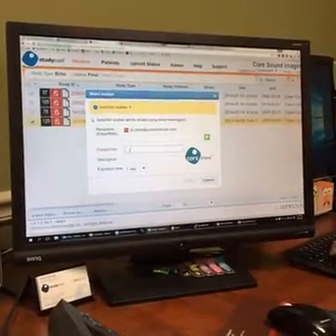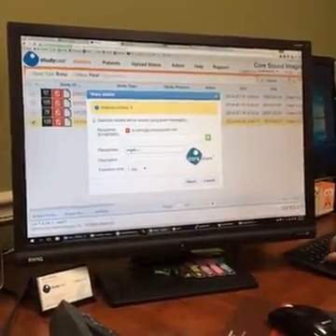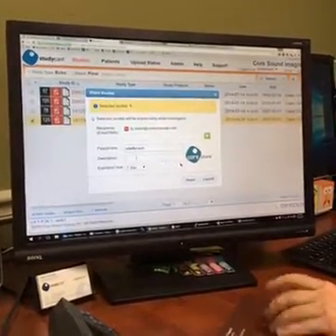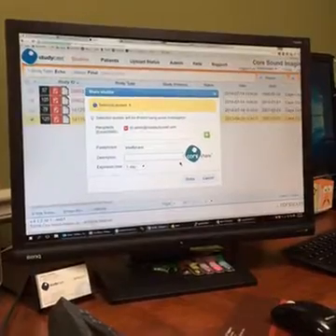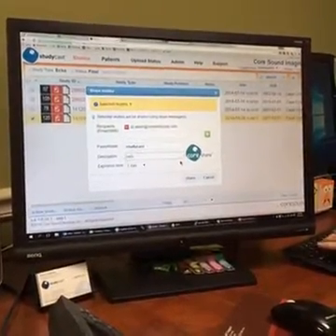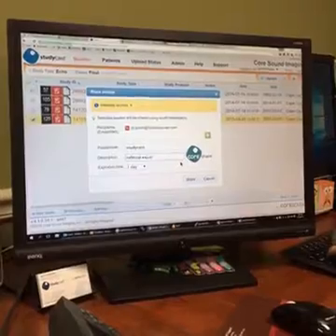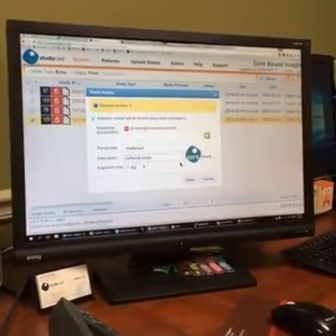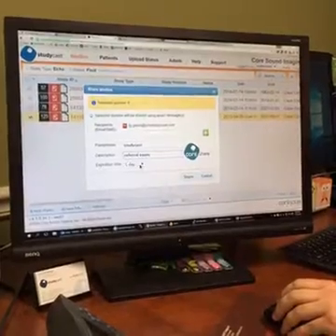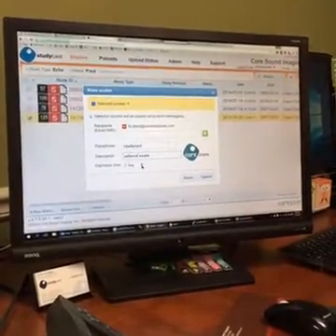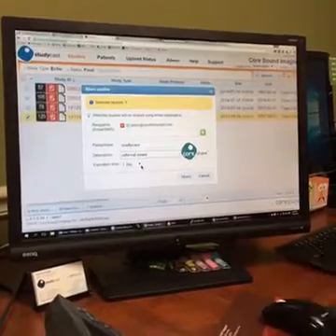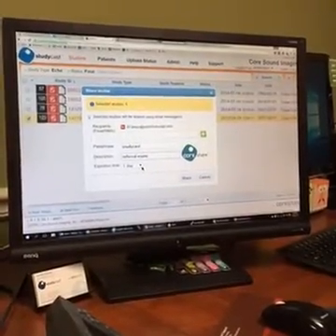So I'm just going to set the passphrase here to the word StudyCast. A description — this will show up in the email that gets sent, so if you wanted to type a description in there, you can do that. The expiration time — the default is one day, which means the link that gets generated would be good for 24 hours.